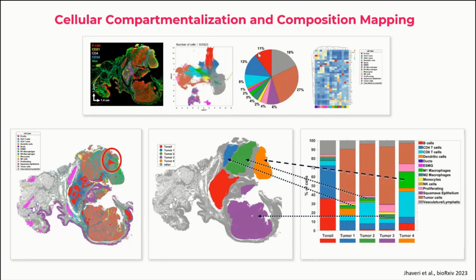And so we can start to identify on two dimensions this partial response to IO therapy. The presence of TLSs in one area of the tumor, which matches up to an M1 macrophage phenotype, but also the absence of TLSs throughout the tumor, but in those regions, the M2 macrophage phenotype is present.